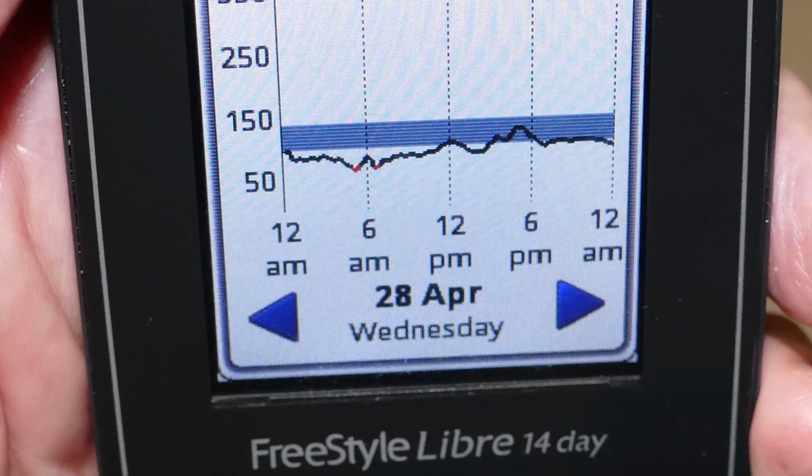You do see a fairly good rise right around, I suppose, 4 to 4:30. So I had a lunch on Wednesday, but the lunch was probably around 1:45, 2, and it lifts it up to perhaps 135 or so. Remember, the top of the bar would represent 140 milligrams per deciliter.